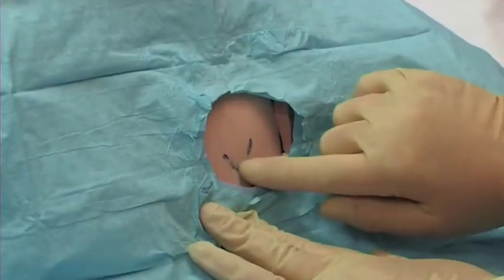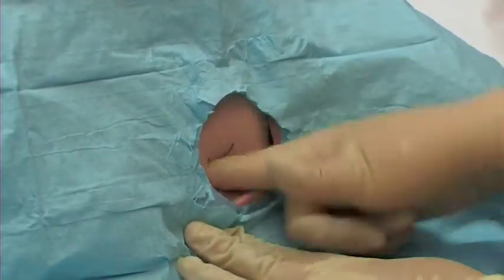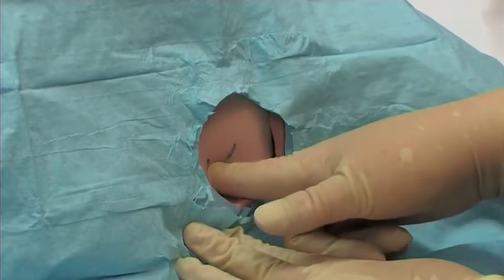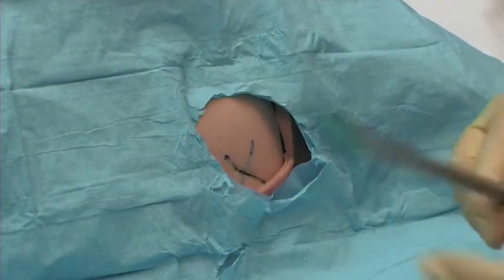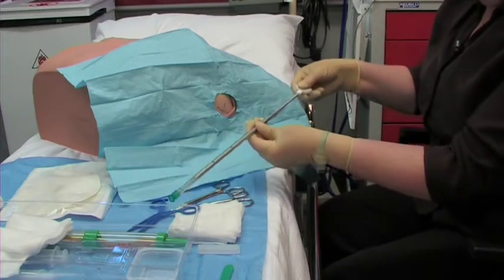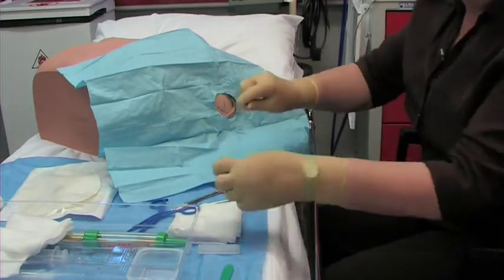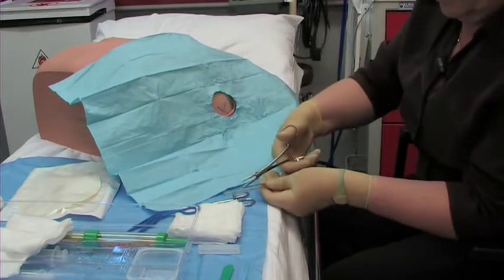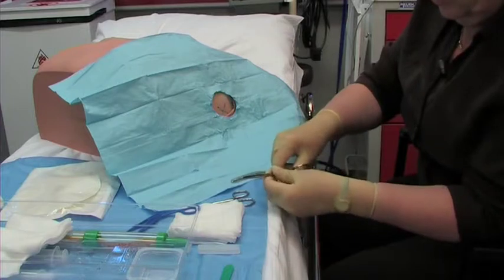An alternative to the forceps is to use your finger to develop a gap in the muscle fibres. Then, prepare your chest drain. The chest drain comes with an introducer — remove this, we're not going to use it. Remove the cap at the top, and using your forceps, insert them into one of the holes at the top of the chest drain.